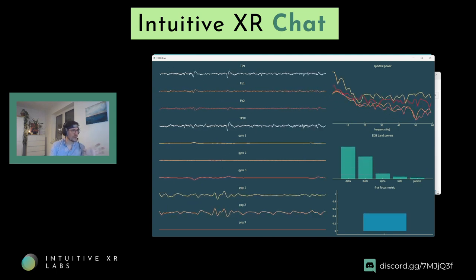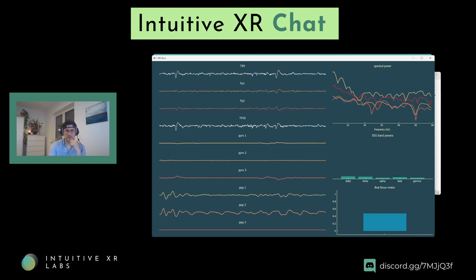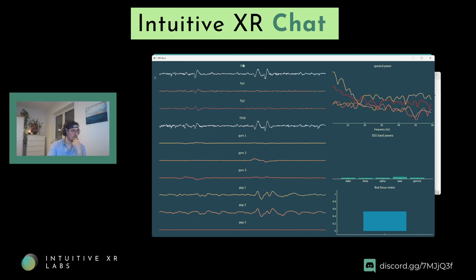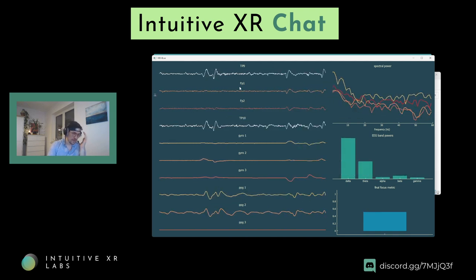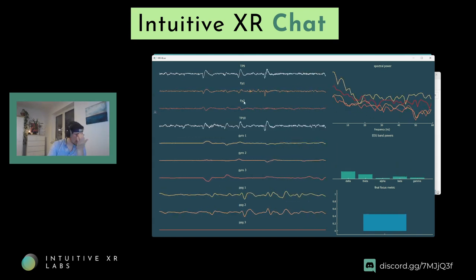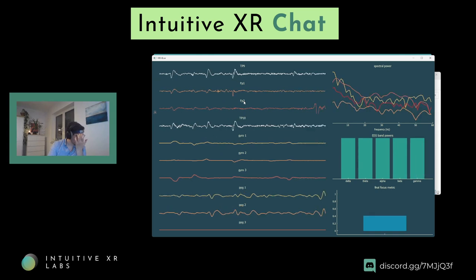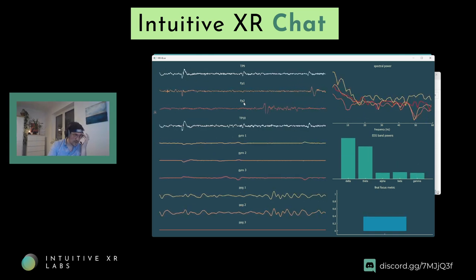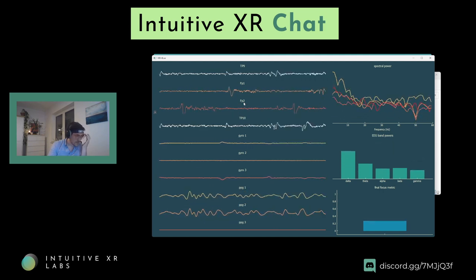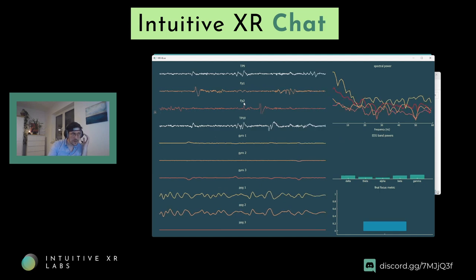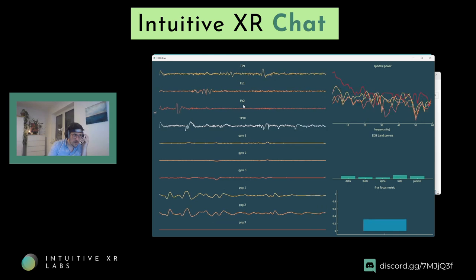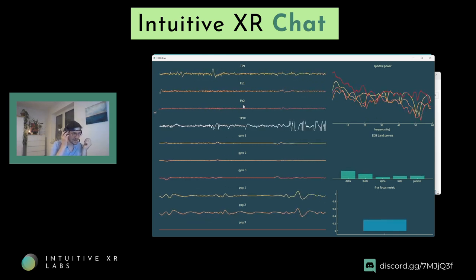This is the Intuitive XR Suite fetching data from the Muse. You can see TP9 — that's the left ear; FP1 — front left; FP2 — front right; and TP10. If I tap here, this is FP2 and this is FP1. The device is a little broken in places, but that's essentially what we have.